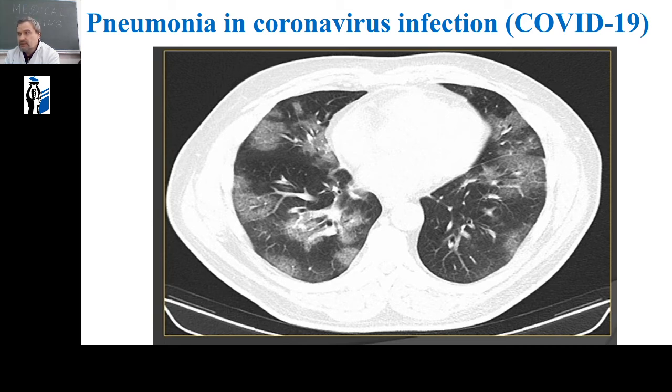Vessels shine through. It also turned out that if the data of the virus RNA tests are questionable, then the result of computed tomography becomes decisive.